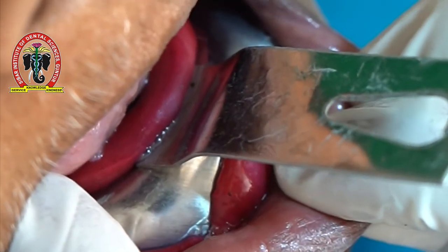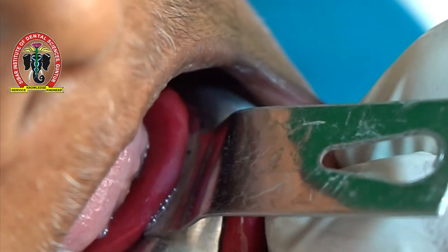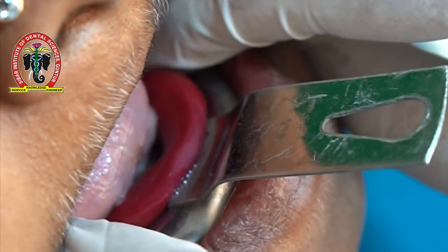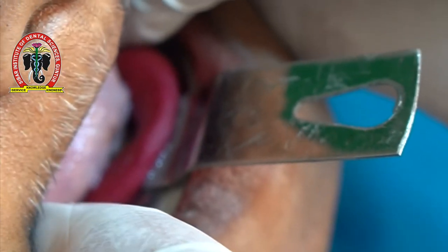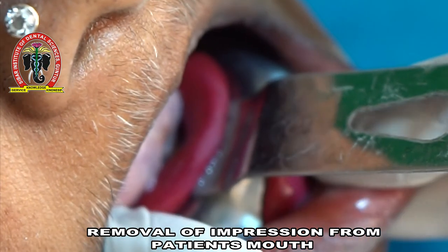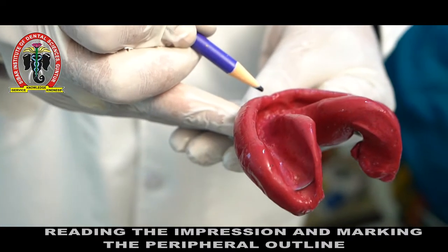Apply pressure with your fingernail — if you get an indentation in the compound, the material is not set. If you don't see any indentation on the compound, then the material is set. Wait a few more seconds so that the internal material also sets, then remove the impression from the oral cavity.